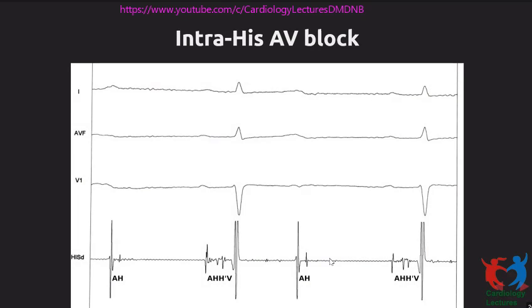And so what can happen is, on EP study, how we establish this is we place a catheter in the his bundle region, which usually records atrial activity, his activity, and ventricular activity. So you get electrograms of atrium, his, and the ventricle. And when we do this, you don't need to know a lot of EP, most of you may not be familiar, but just to tell you what we look for, we have the ECG where we see a P wave conducted to the QRS.